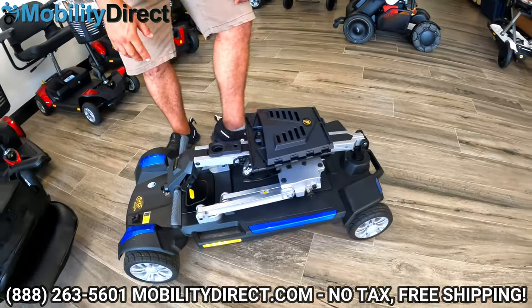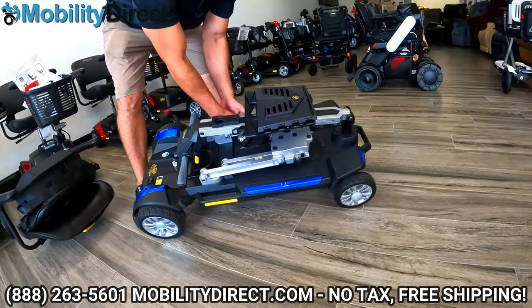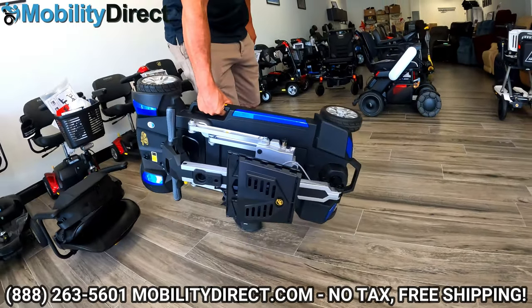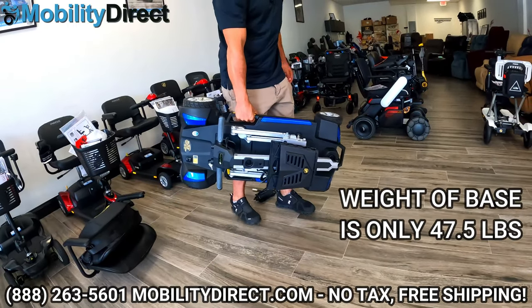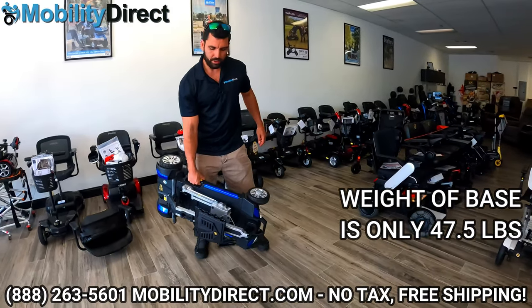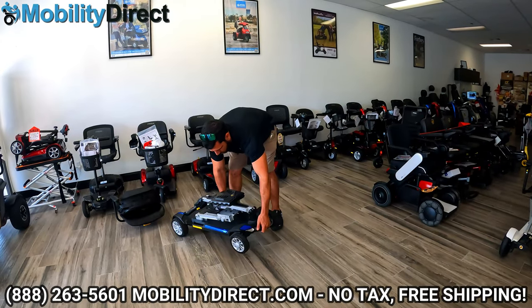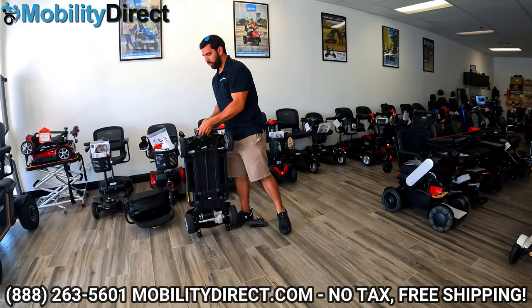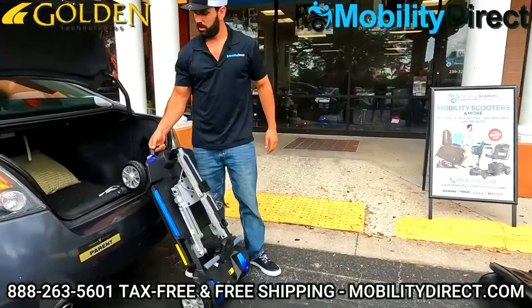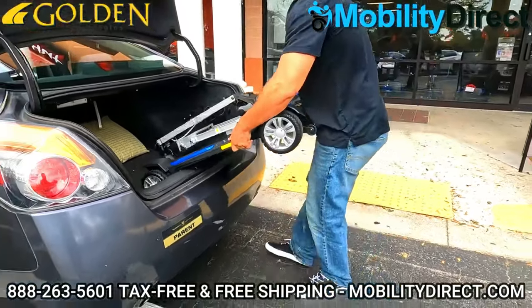Now you can actually grab one of the handles on the right or the left and carry the scooter like that. It is kind of heavy, but for some people it's very possible to carry this depending on their physical strength. You also have a handle in the front so you can roll it right up to the trunk of the car, then grab the handles on the side to cantilever it into the trunk of your car.